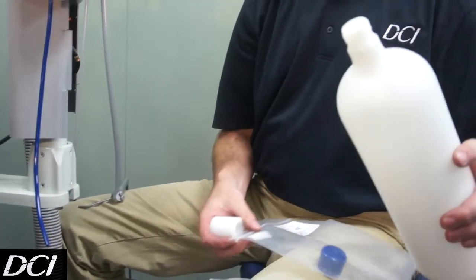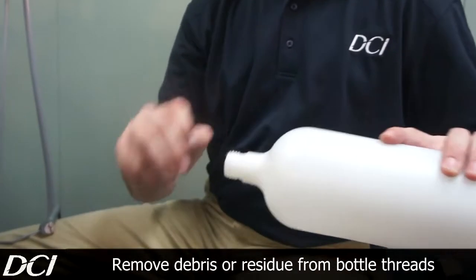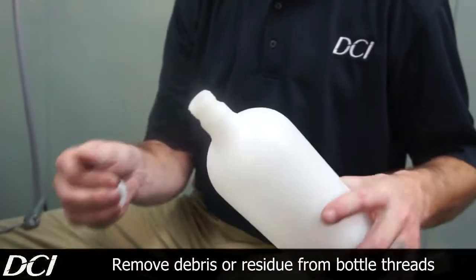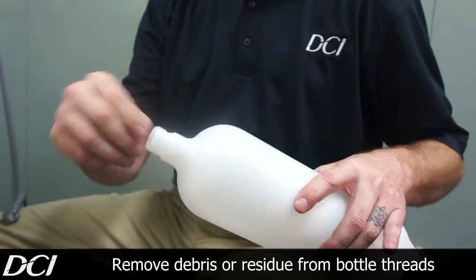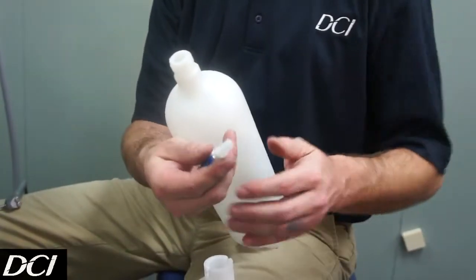The first one I like to start with is going to be the bottle. This bottle has a little bit of wear to it — I just want to make sure it's cleaned up, that there's no debris, no residue, anything like that.